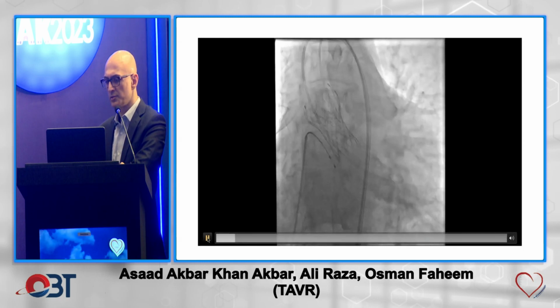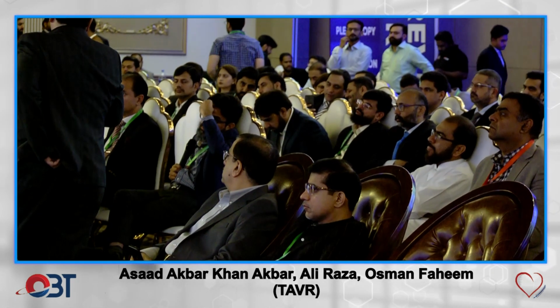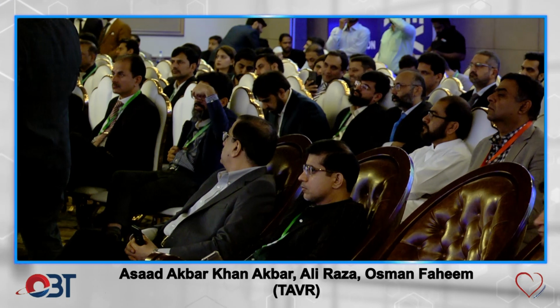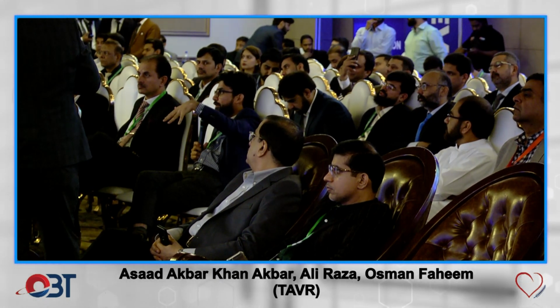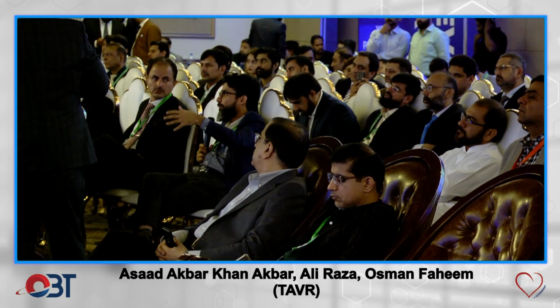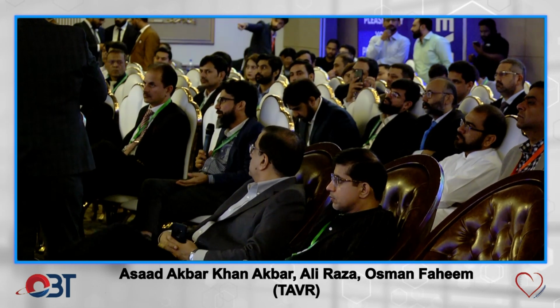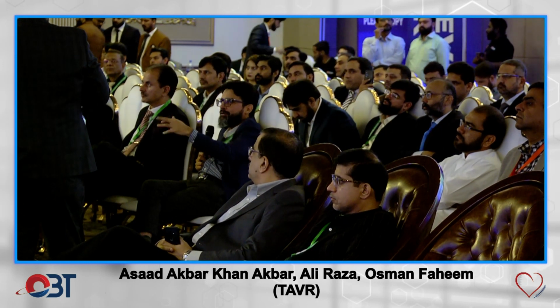So one thing I would do different, Usman Bhai, is when you're releasing, I really bring the wire all the way inside the nose cone, so the nose cone essentially has no wire hanging out. And that ensures that you really have a lot of tension and the valve is really not going to pop out. Once you have that nice loop inside the LV, you don't really know what kind of forces, what kind of mechanical conflict exists inside the system. So I think just pulling it all the way, the nose cone centers all the way, and then you release your pedals.